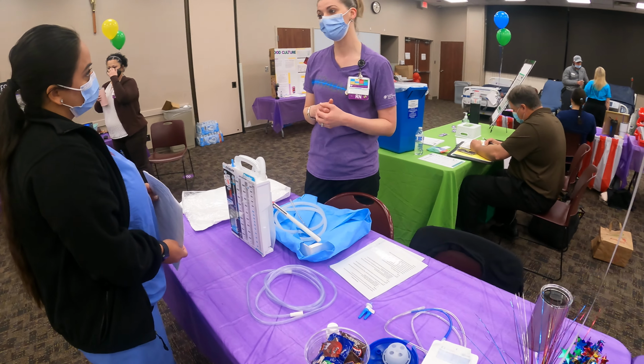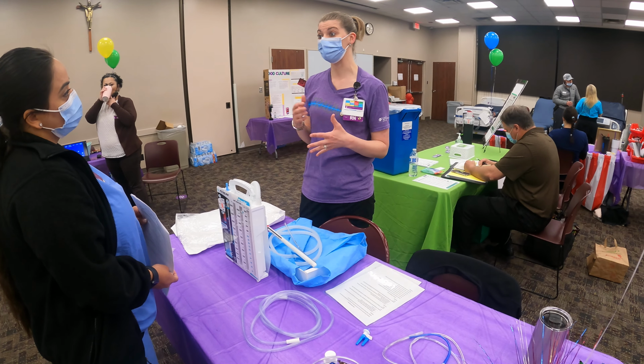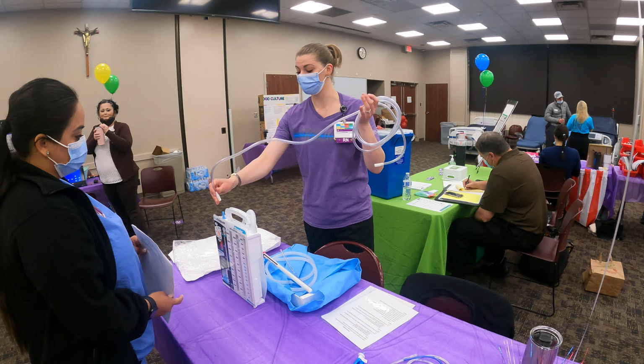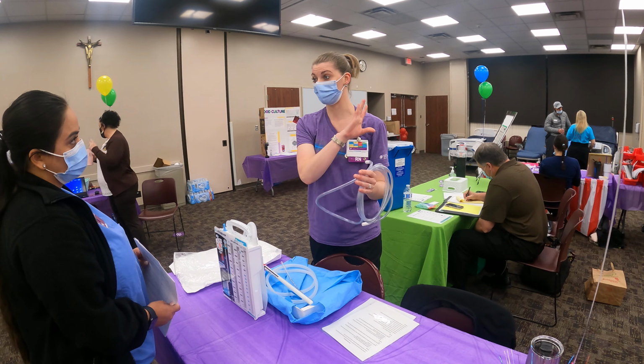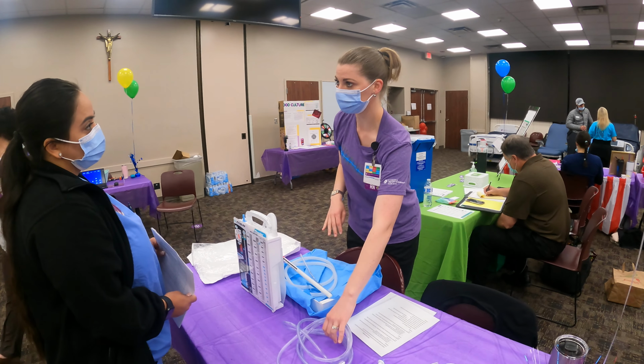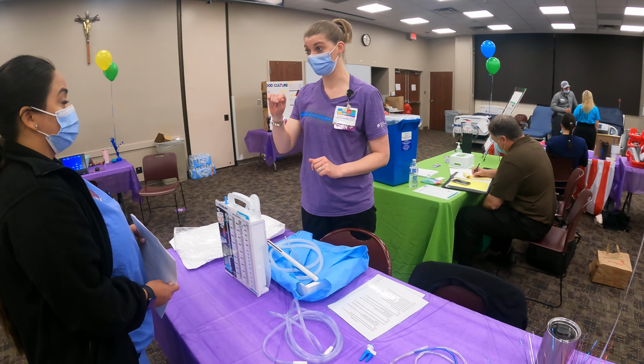So if a patient comes up to the ICU and they're hooked up to suction, they're hooked up to this tubing, right? That goes to our canister. It goes to the regulator on the wall. The regulator on the wall, do you know what we set that to? Yes. So you set it to regular, okay?